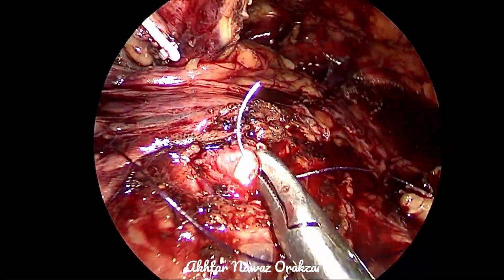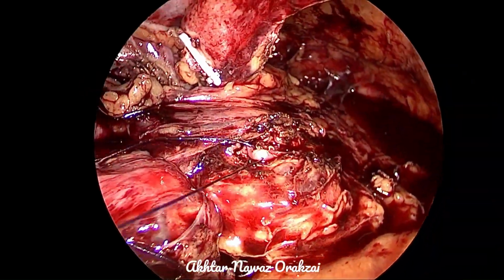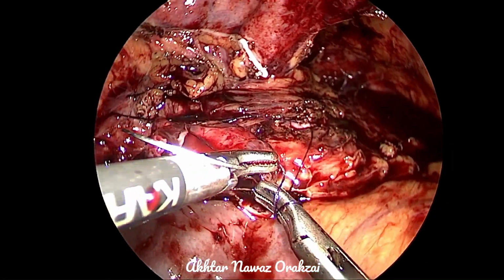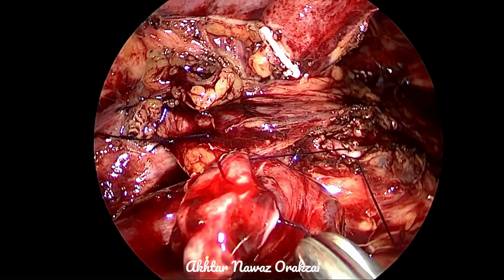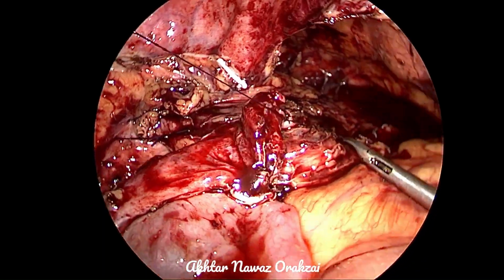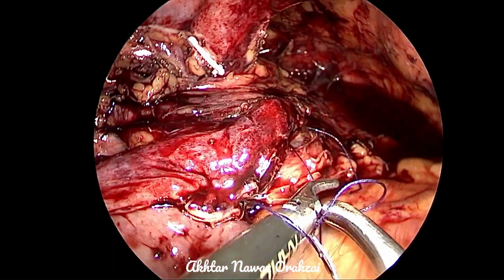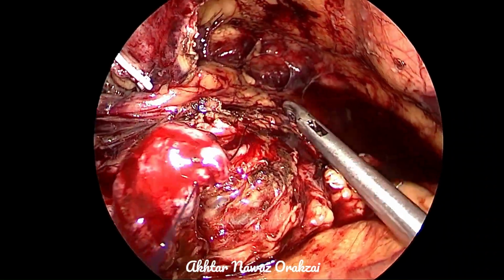So outside in from the ureter and from inside out into the bladder. And now making a loop, taking a surgeon's knot. The first knot must always be a surgeon's knot, so that it does not slip, because leakage again may lead to stenosis.